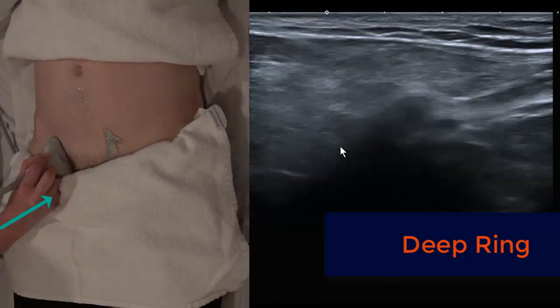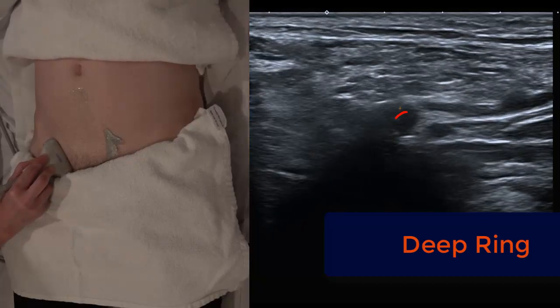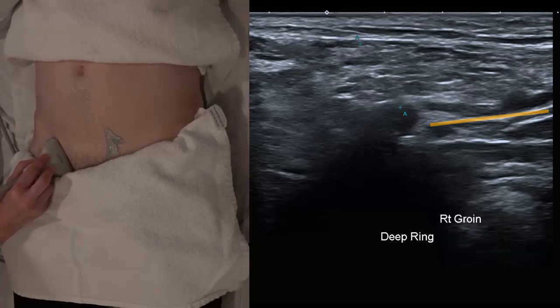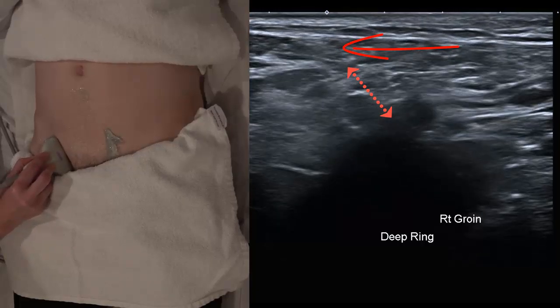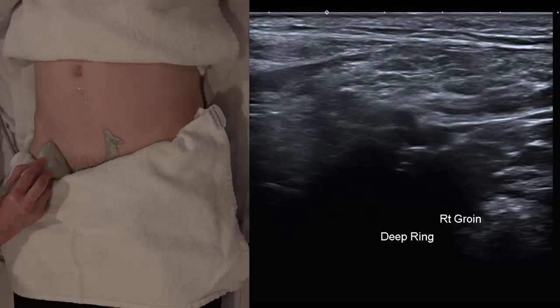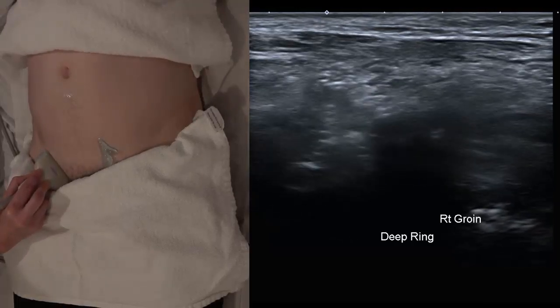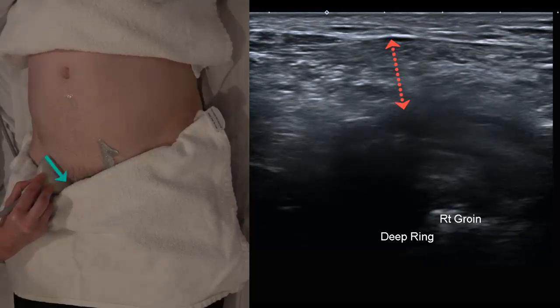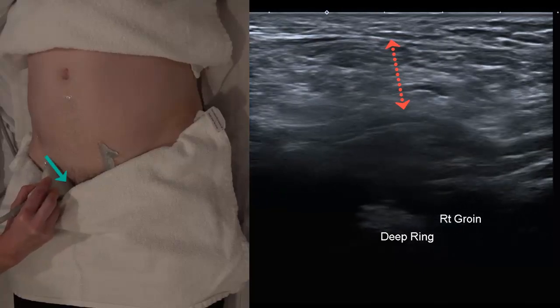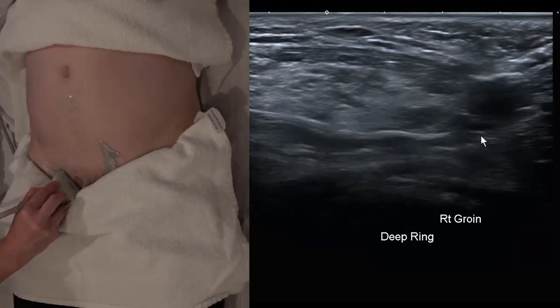Now lay the probe flattened as if coming in from a lateral approach. Still try to find that little inferior epigastric vessel. Find the deep ring with the patient relaxed, then get them to strain. We're looking between that little triangle which is the remnant of the internal oblique muscle, beneath that as they strain, taking the pressure off the probe. A true hernia will either contain fat, fluid or bowel. We can't see veins so it's probably not the spermatic cord — it's likely a little hernia.